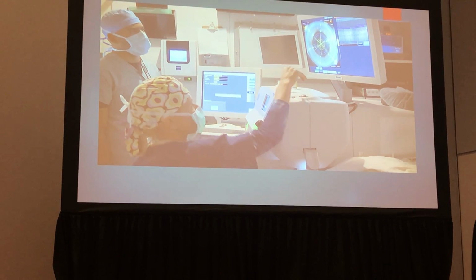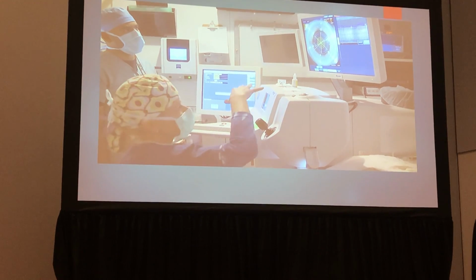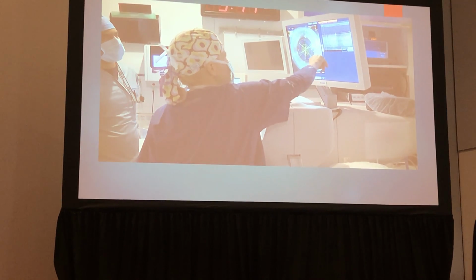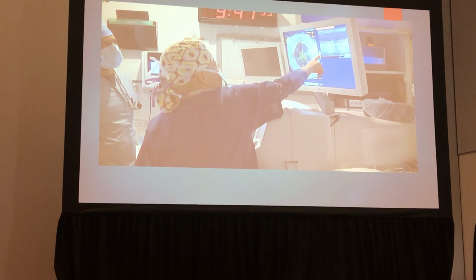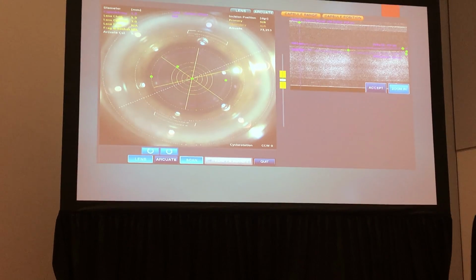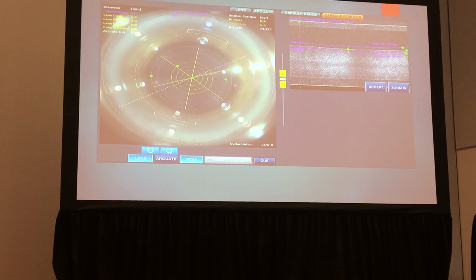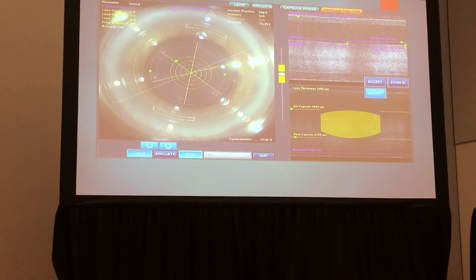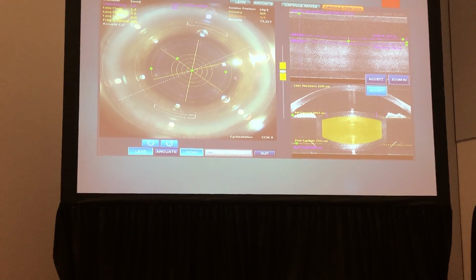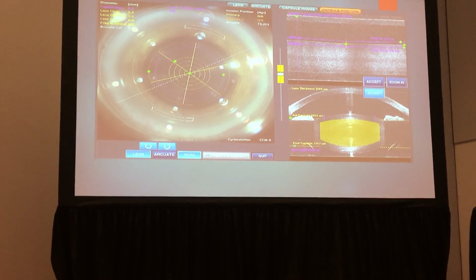So we're looking at her capsulotomy, and actually we don't have any real lens tilt here. We have the lowest point and the highest point marked, and this line here marks the highest point on the back side, which is pretty much flat, so that actually looks really good, so I don't have to change anything. We'll go ahead and accept that. Again, you can see we don't have any lens tilt here. When you do have lens tilt, you're at higher risk for incomplete capsulotomy.